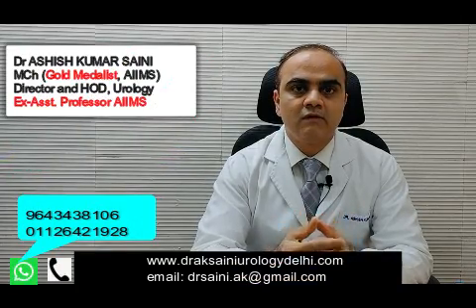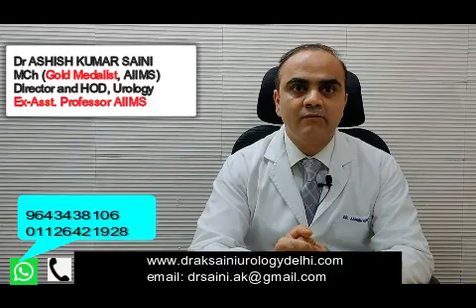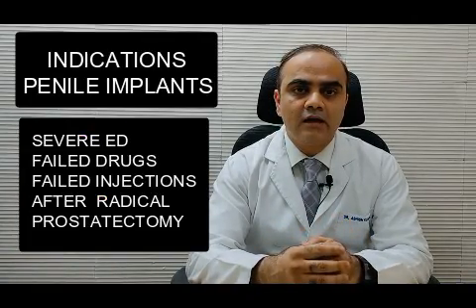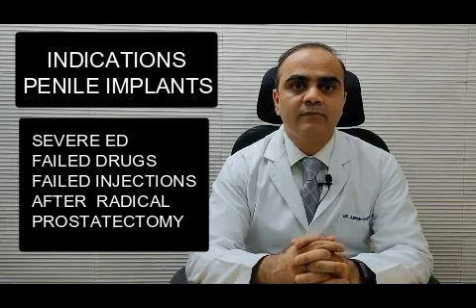So this is one of the videos where we'll be talking about the penile implants, the rigid ones, the inflatable ones, the 2-piece and the 3-piece. And first of all, what is the indication of a penile implant?